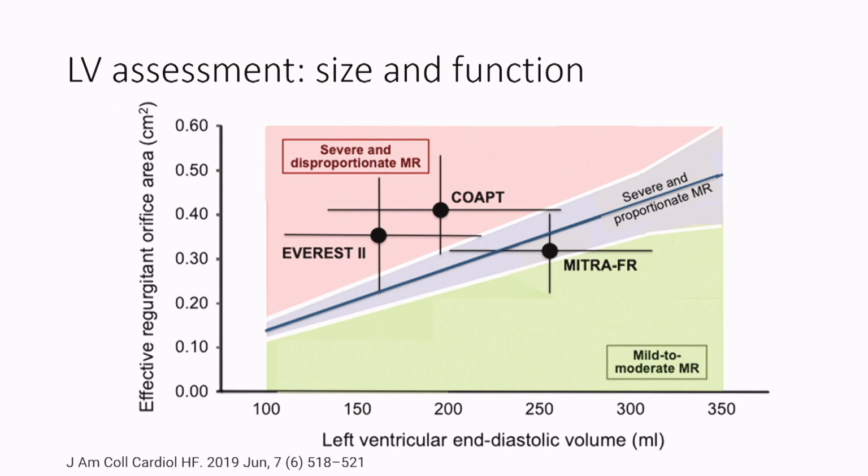The only explanation is the selection of patients for MITRA-FR: the MR was proportionate to the LV dilatation, and those patients have less benefit from edge-to-edge repair.